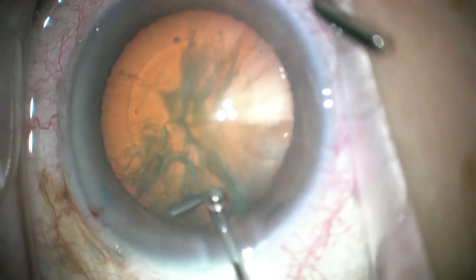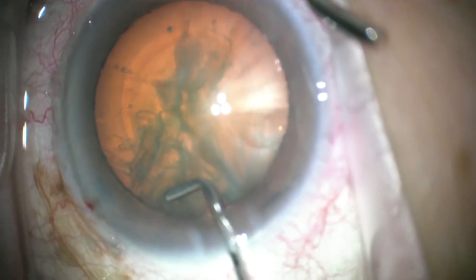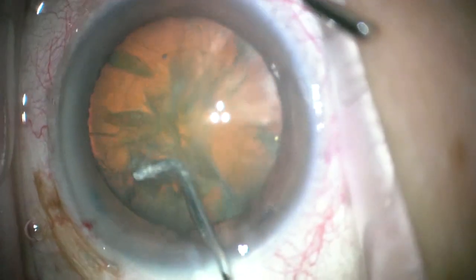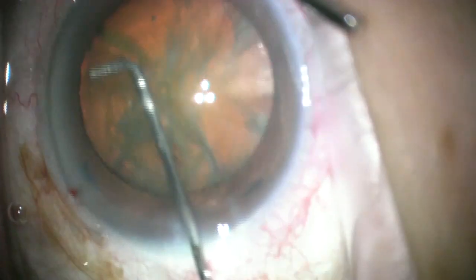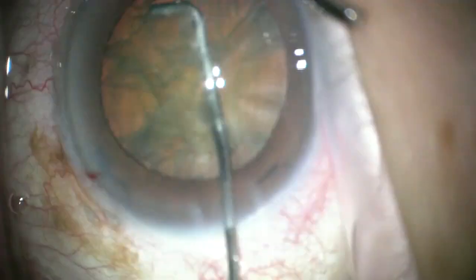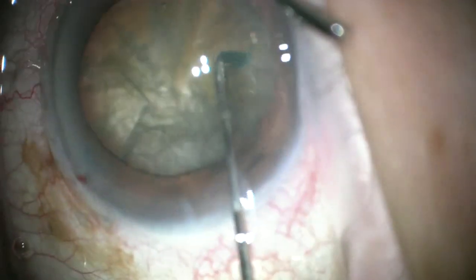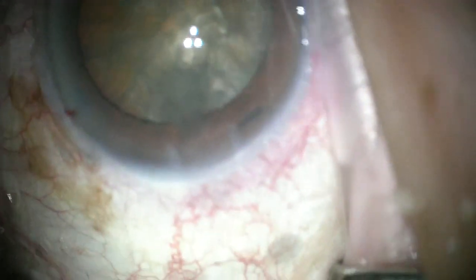For hydrodissection, I like to start sub-incisionally right under the capsule with just pulses until I see the fluid wave under the lens. Then I press down and pull a little bit toward the center to loosen the equatorial part of the lens from the capsule. A little more irrigation until I can get easy rotation of the lens to make sure the lens is free.